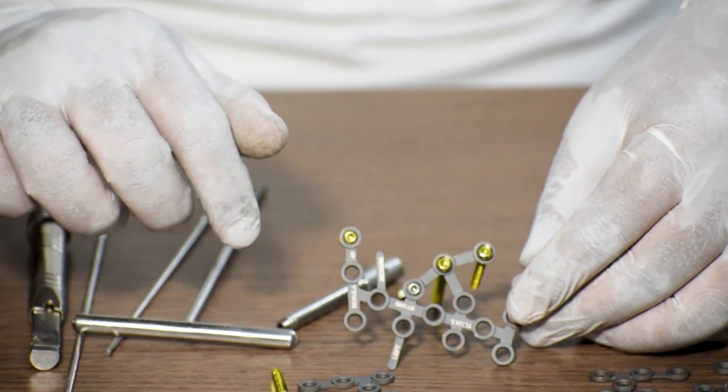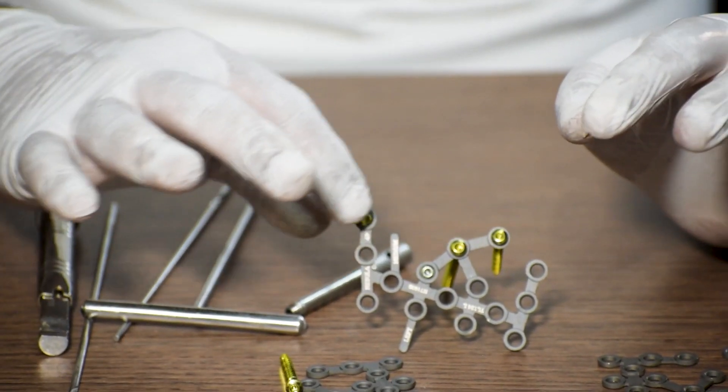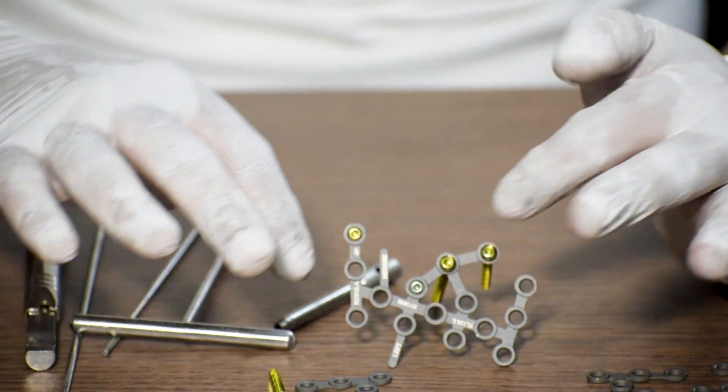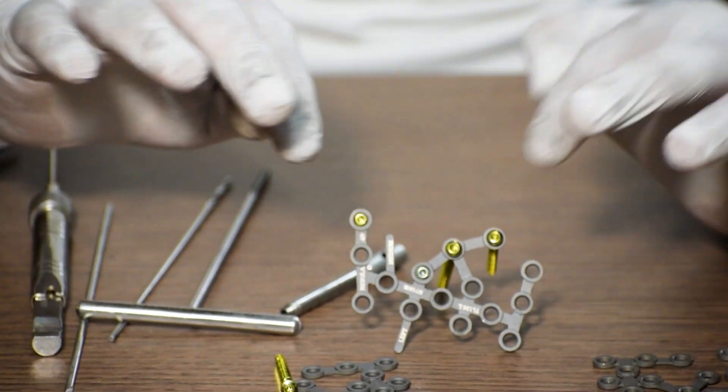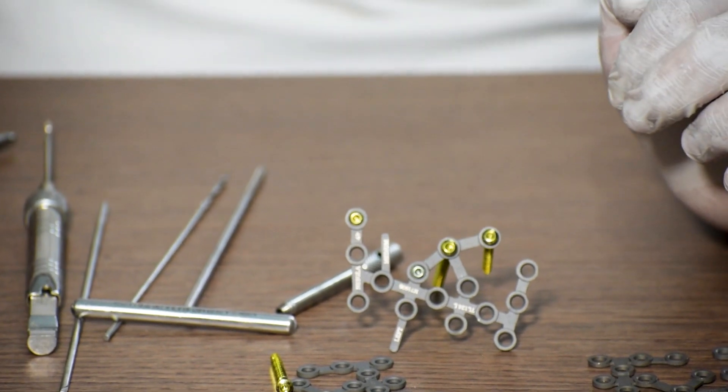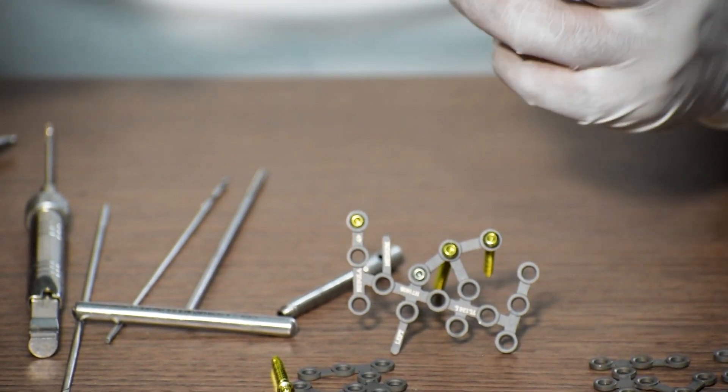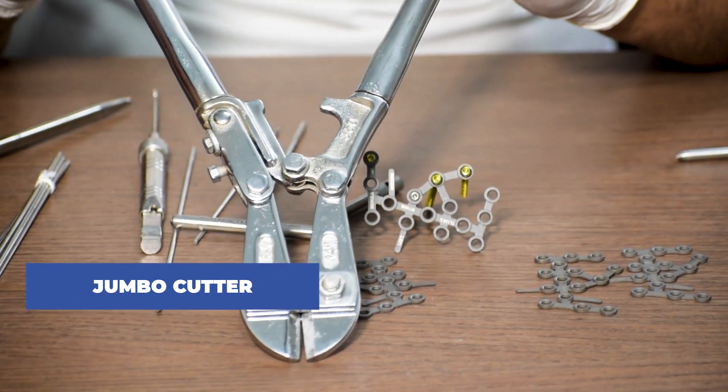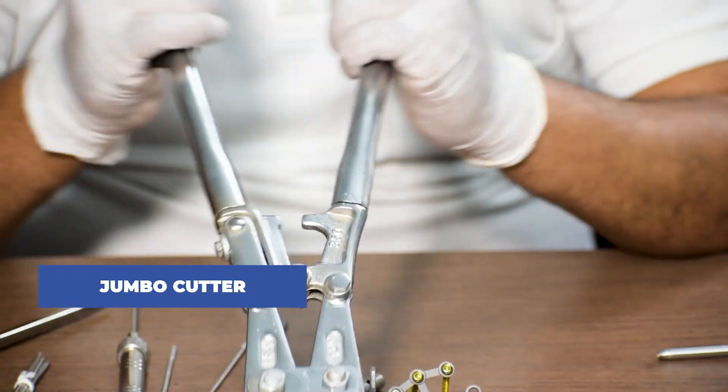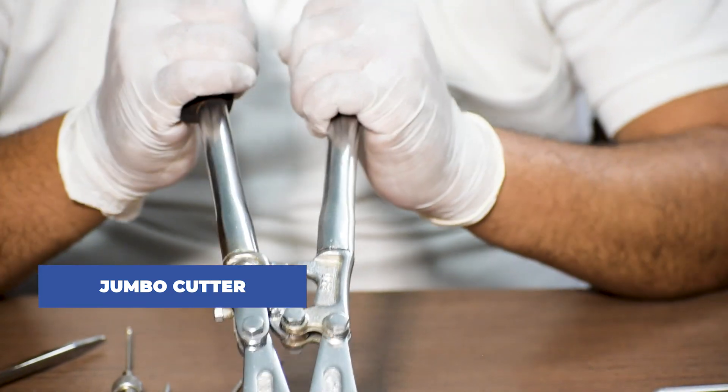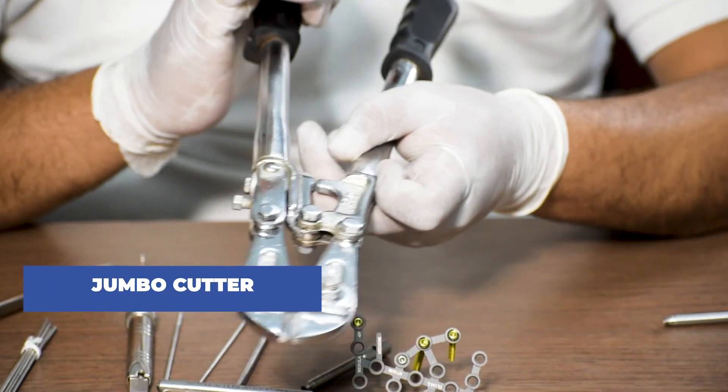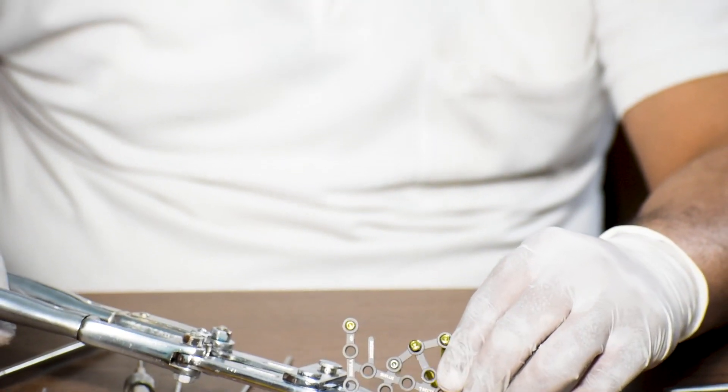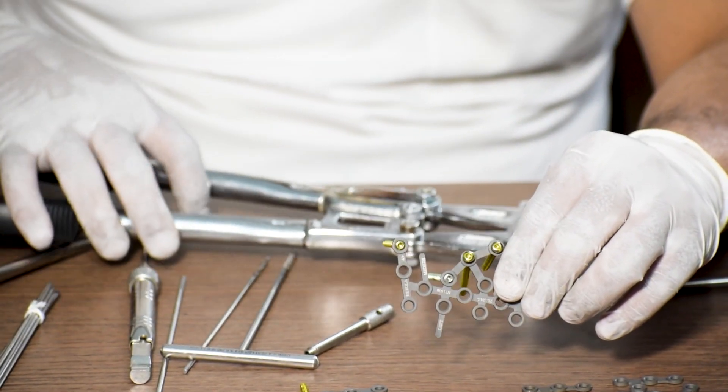Make a note here, for a calcaneal locking plate, at times it might be needed to cut the plate from places in order to get the perfect fit for the fracture site. Because at times calcaneal fracture might differ from person to person. That's when we will need a jumbo cutter. This will help us to cut the plate and it is a very important piece of equipment needed. This can help us to cut the plate from any angle.